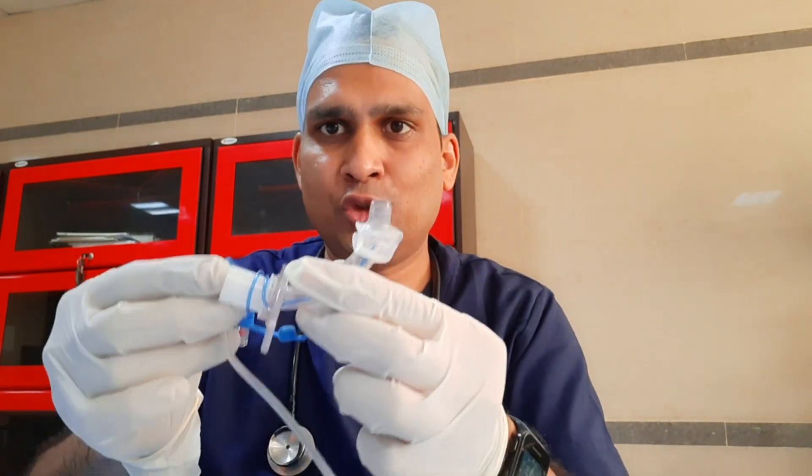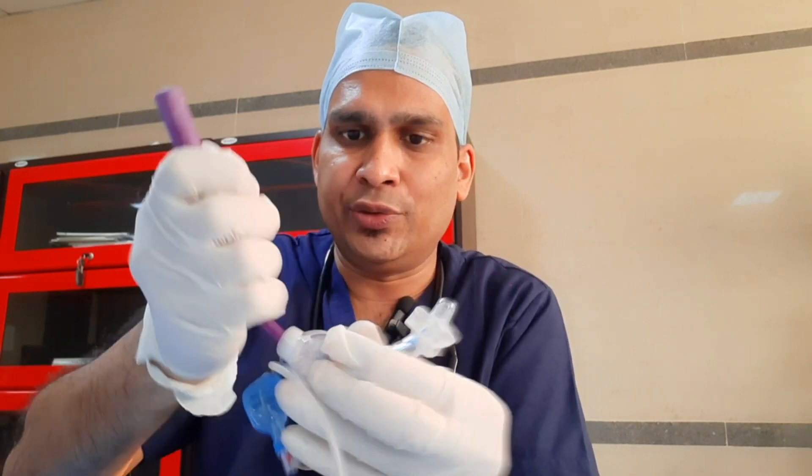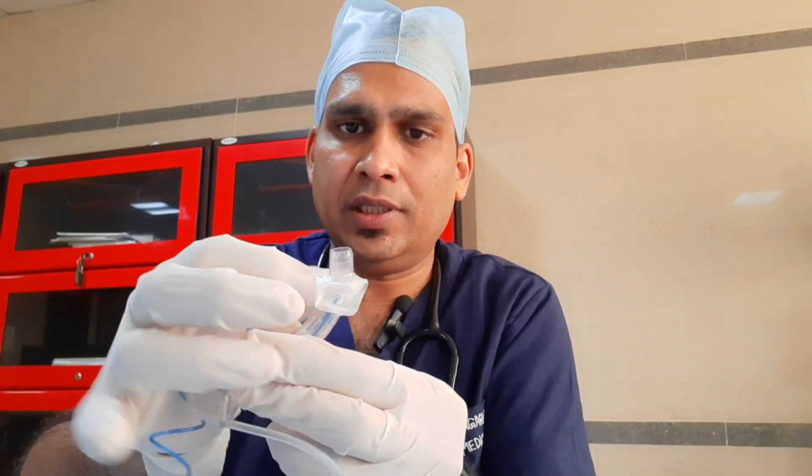This is the trachea tube and this is the introducer. We will insert the introducer into the trachea tube and go upward to downward. Once we insert the trachea tube, we will remove the introducer. After that, we push air inside this balloon so it inflates and fixes the trachea tube inside the trachea. This is all about the instruments — now let's see the live procedure.